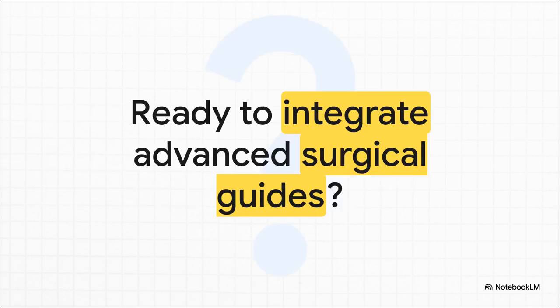So we'll end with a final provocative thought for you to ponder. Are you ready to integrate advanced surgical guide technology to elevate your next implant case? Honestly, understanding these classifications takes the anxiety and the guesswork completely out of the process. When you match the right guide to the right clinical situation, you are paving the way for predictable, efficient, and truly exceptional success.